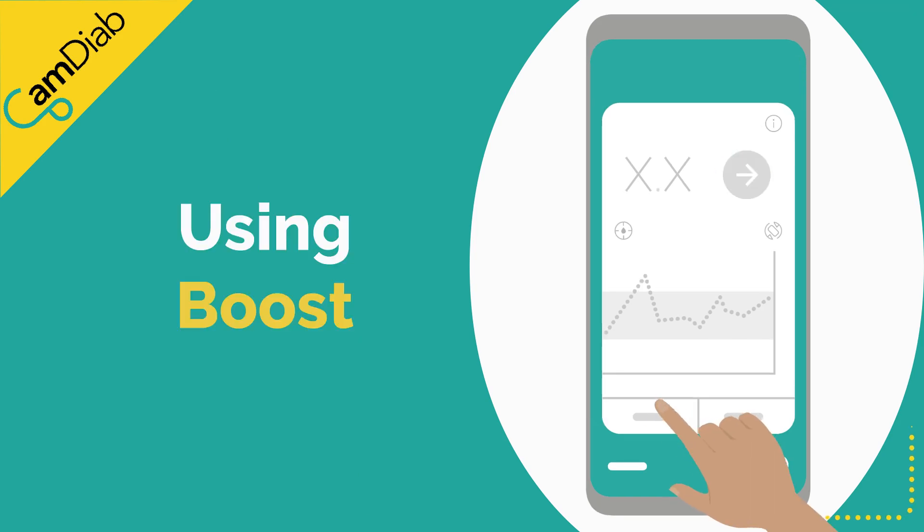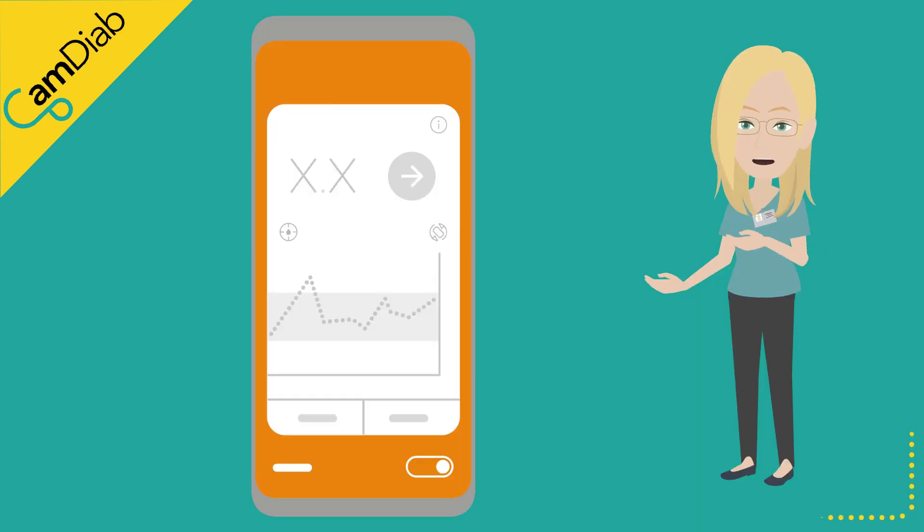Using Boost may be a better way to help CamAPS FX correct high glucose levels without increasing the risk of hypos. However, there may be times that a manual correction is needed, such as when auto mode is not working and the pump's pre-programmed basal rate is running — for example, when the sensor is warming up.